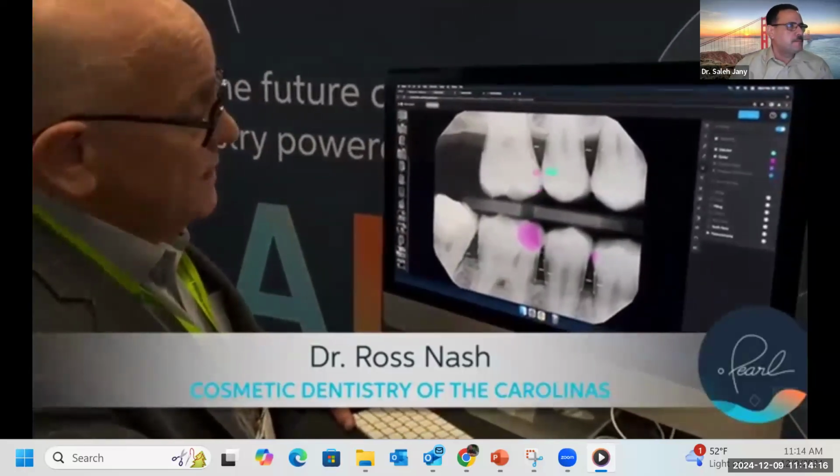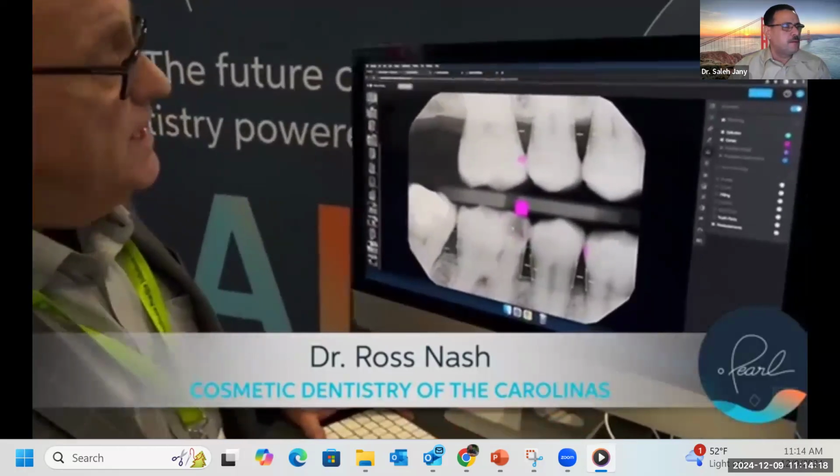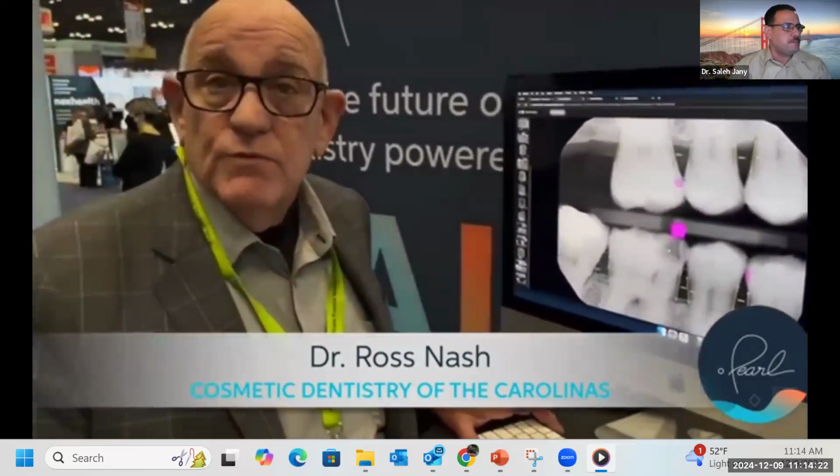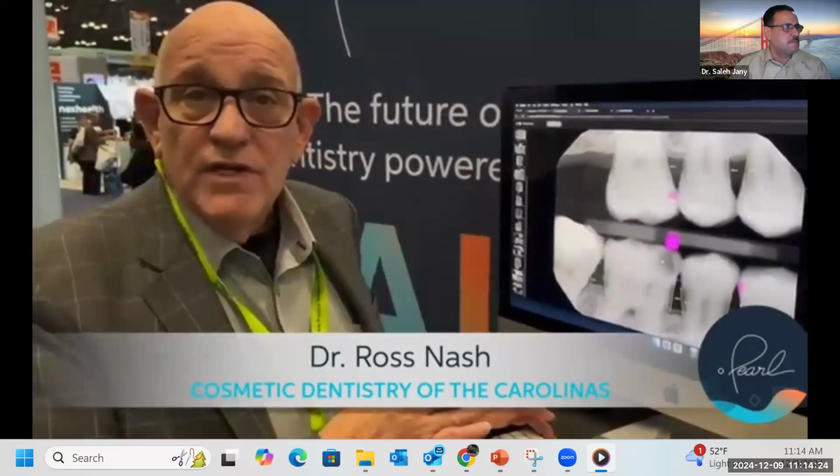Now, on the other hand, take a look at the third one here, 73% dentin. You can't wait. In order to save that tooth, you've got to remove it. This gives me a great way to do it.